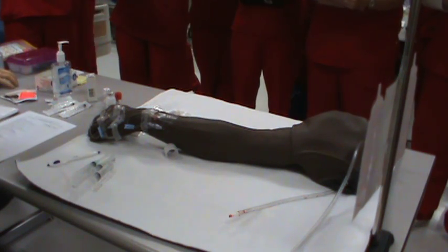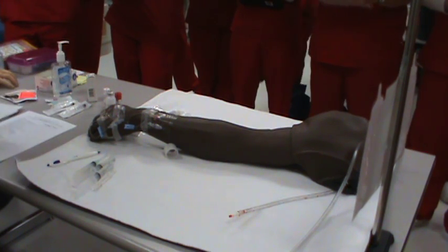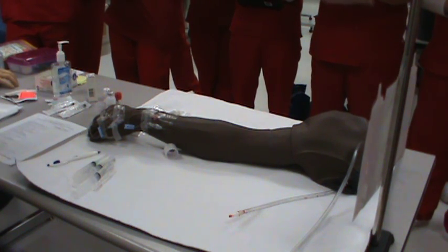You're going to verify your order. So when you come in for testing, we'll give you one of these. I'll have a selection. You verify your doctor's order, medication allergies.